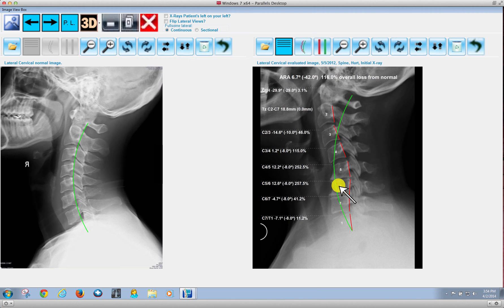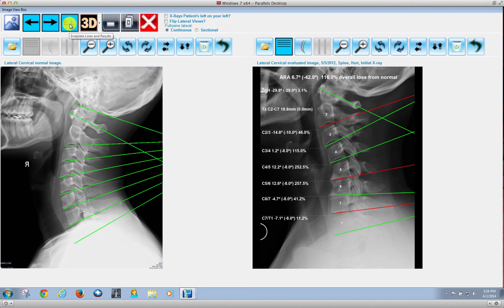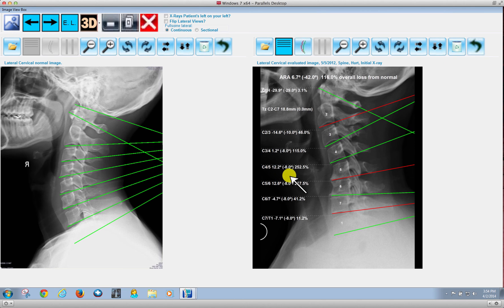And notice that we are now labeling it as well. There's also a new button up here — if we change this, we can go ahead and do posterior tangents, as well as impression lines. If we do the end plate lines, if available, we'll go ahead and switch to the end plate values. Notice the relative angles are different based on the AMA guides, because it's one motor unit compared to the next motor unit on how the angulation is.